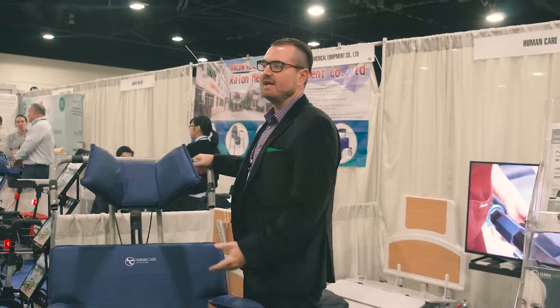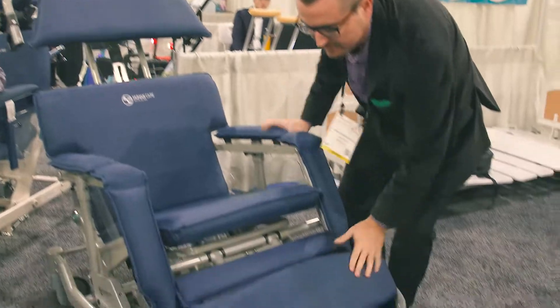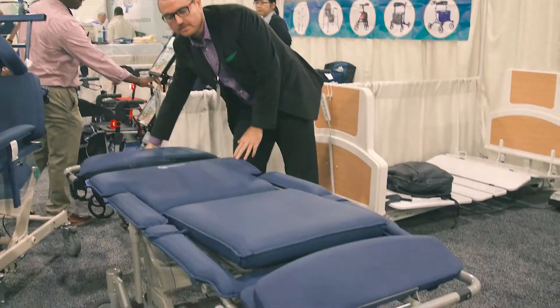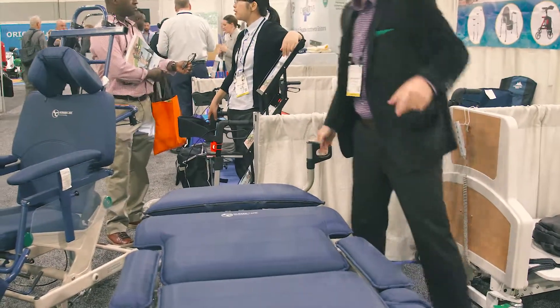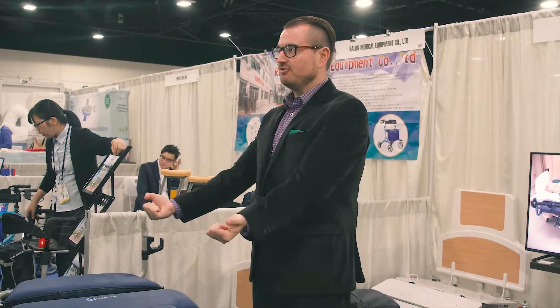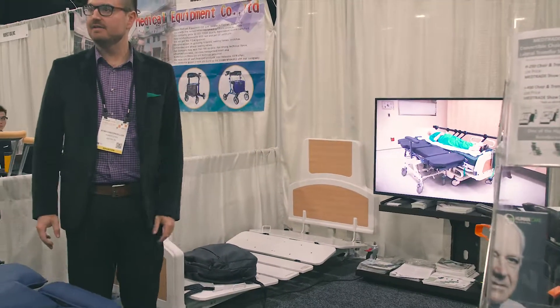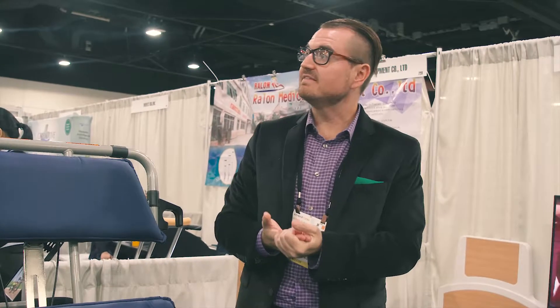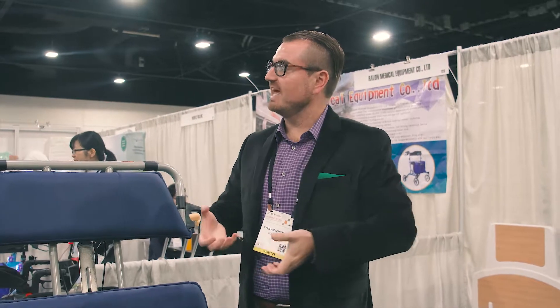One unique thing about this chair is that it was designed to work as a single caregiver transfer system as well. Basically, you lay it flat, go up next to the patient's bed, and there's a transfer bar that connects right onto the chair. It pops up and pops out — there's one on the foot as well. The transfer bar connects to the sheet the patient is already lying on. You turn a little handle — it's only four and a half pounds of pressure to do the transfer — and it gently brings them over into the chair. It connects to the head and footboard of their existing bed, so it works with any hospital bed.